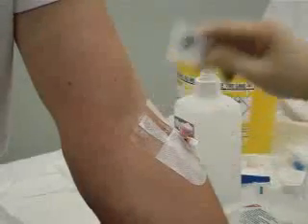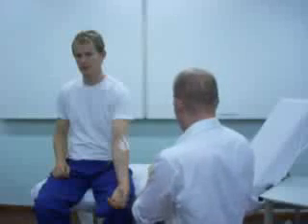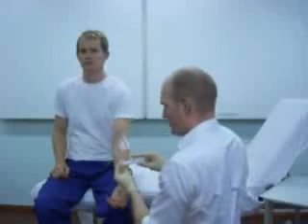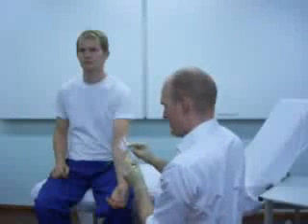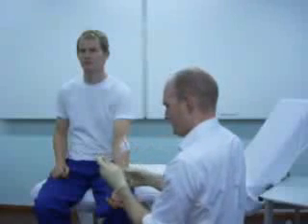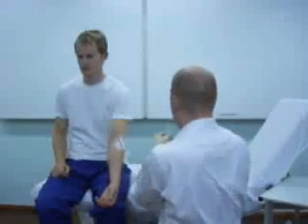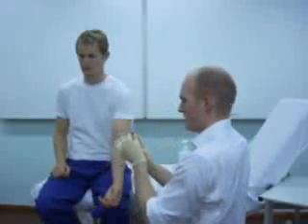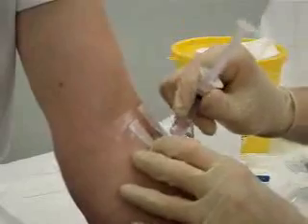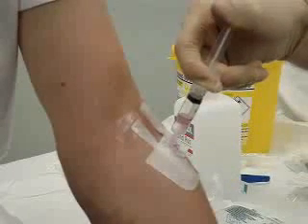The final thing that is left to be done is to flush the cannula with some saline to check it's in position. So what I need is a syringe, some normal saline, that's sodium chloride 0.9%, expires March 2010. Take that off, draw up a small flush, make sure I've got all the air out of the needle, and then simply pop the flush into the arm, and then you can see it's flushing with very little resistance.